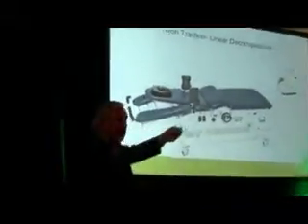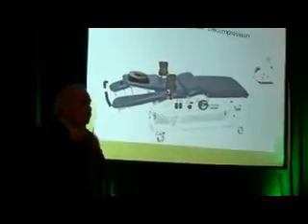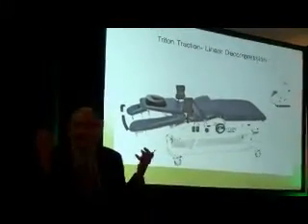Here's a Triton table that was tried on an earlier patient many years ago, with no effect, but this will help patients with simple posterior disc herniations. I don't treat only simple posterior herniations. I treat people coming in like this, and I'm not going to put them like this to stretch them. And that's what this is all concerned about.